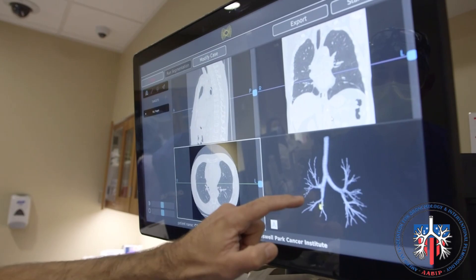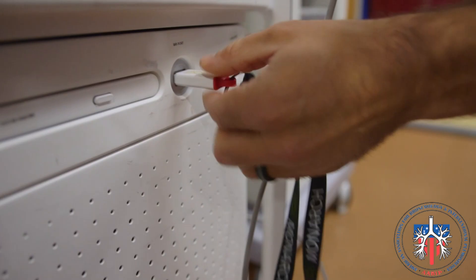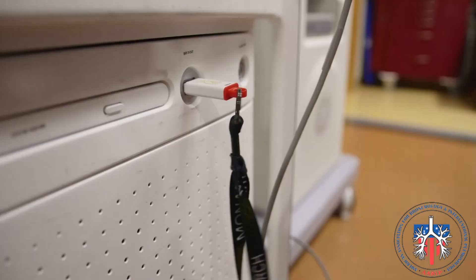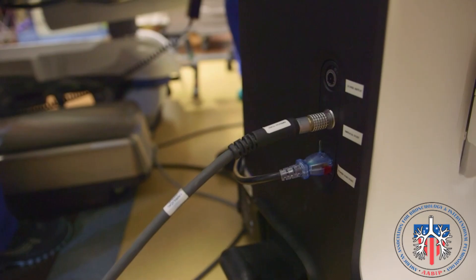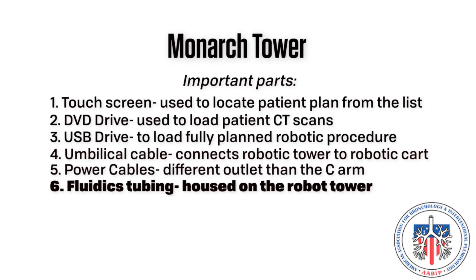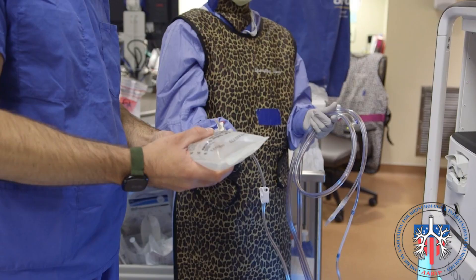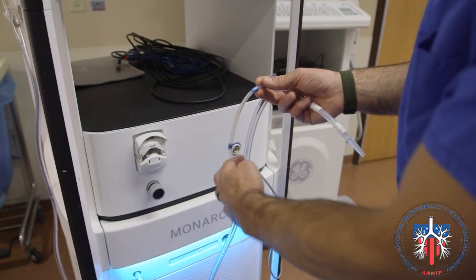Number three: USB drive and USB drive connector, used to load the fully planned robotic bronchoscopy procedure. Plans are performed on the planning laptop and then brought in and loaded using the USB into the USB port. Number four: umbilical cable, which will connect the robotic tower to the robotic cart. Number five: power cables — the power cable must be plugged into the wall at a different outlet than the C-arm. Number six: fluidics tubing, housed on the robot tower with the saline bag hung from the side. Number seven: suction tubing, which will pass through the robotic tower and will be connected to wall suction.